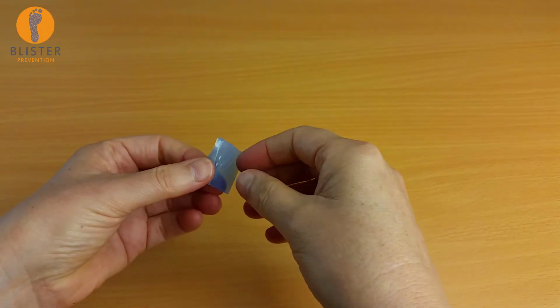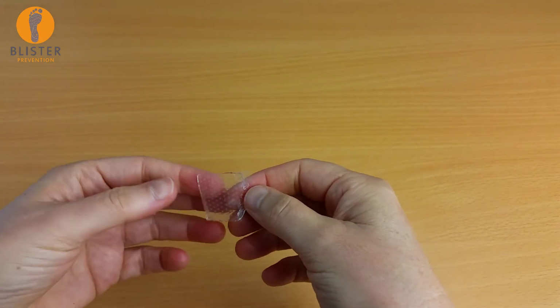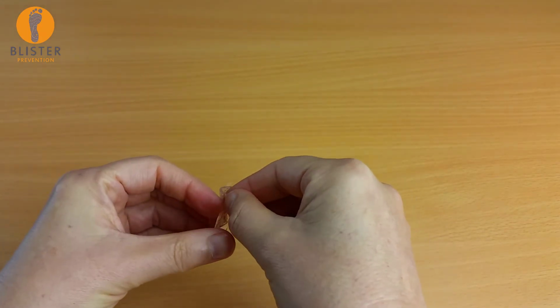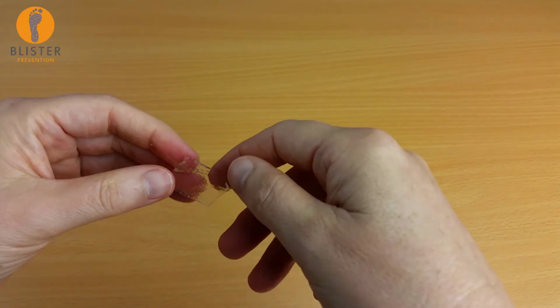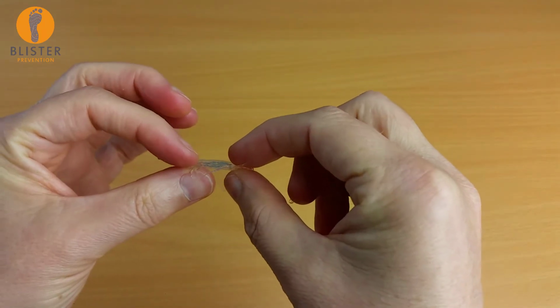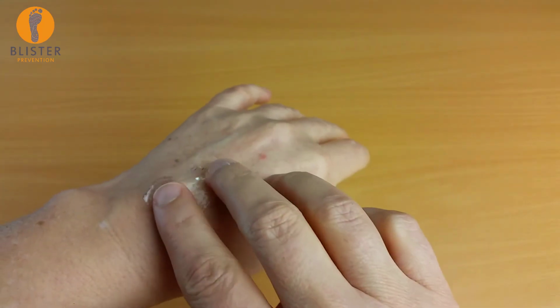Now, the instructions say to remove the blue backing, put it on your skin, and then tape over it. And I agree, this is the best way to go. That clear plastic film between the gel and the tape means there's less water absorption by the tape and less evaporation of water through the tape. So it will last longer than if you just take the plastic off both sides and put it on.